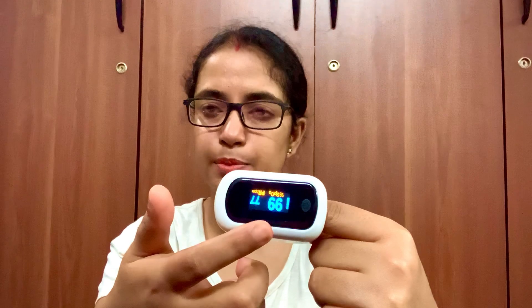This reading is oxygen saturation level and this one is heart rate. My oxygen saturation level at present is 99%. Now, you just have to unclamp it, then remove your index finger, and it will get switched off by itself.